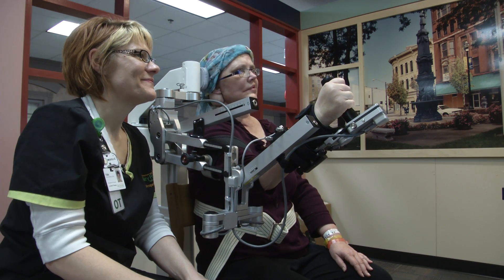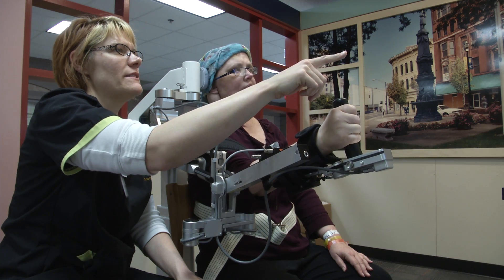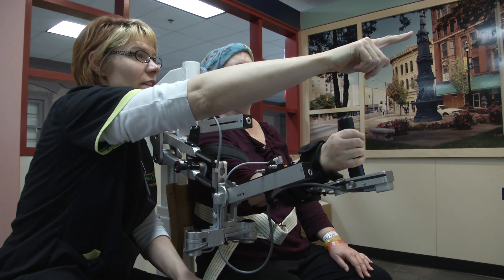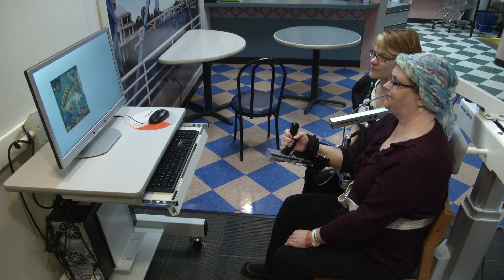A lot of our oncology patients will have areas of their brain that affect motor movement, so we like to use different neuro rehabilitation training techniques to help them regain some of that movement or to get movement in that they would normally do but can't do on their own.